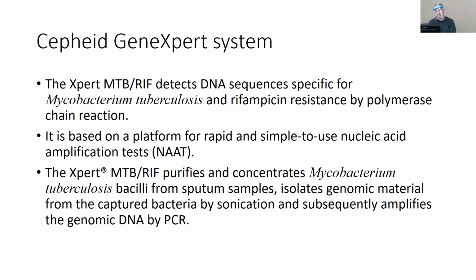So she showed me how she went about taking the swabs for COVID and put them in the Cepheid cartridge, and the cartridge was red for positive COVID presence or not. Give you an idea, this is here. So this is not something that you're gonna have to go to AEL to get. This is something you get here, and it's being used today.